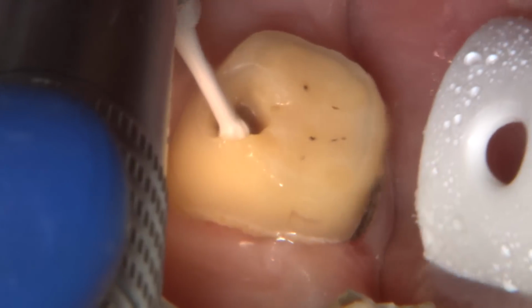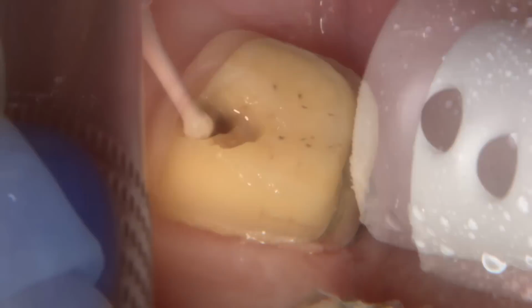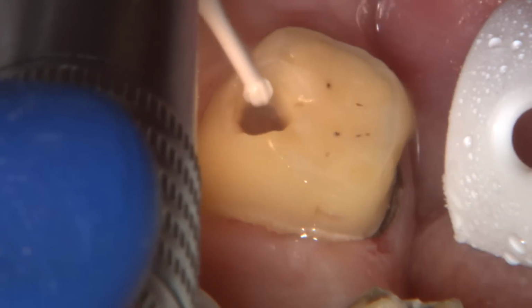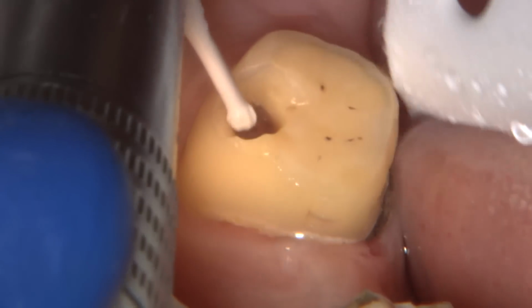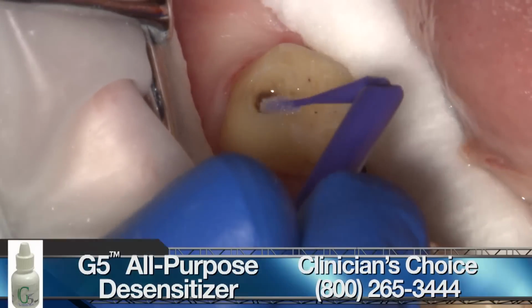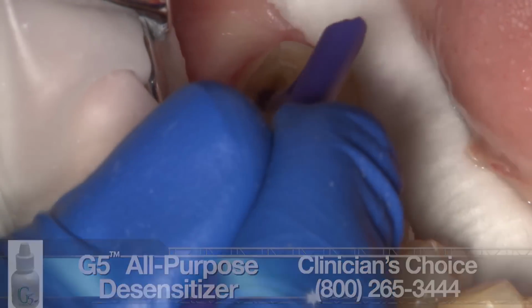In my experience, using this burr is a lot safer than using conventional low-speed carbide burrs. When used at 2000 RPM, I can feel when I am in healthy dentin because this burr will start skipping when sound dentin is reached. Just before cavity closure, here you see me using 2 successive coats of cavity desensitizer G5.